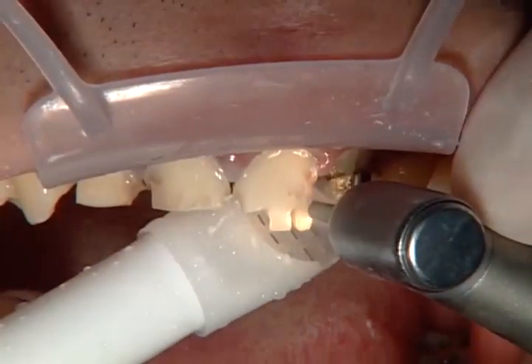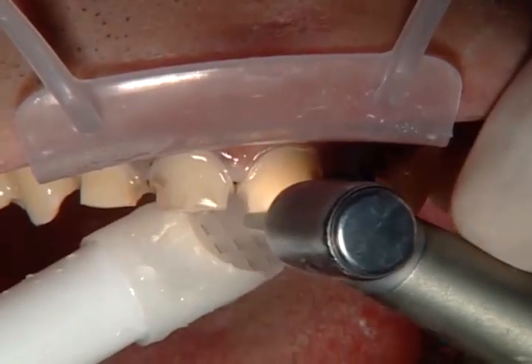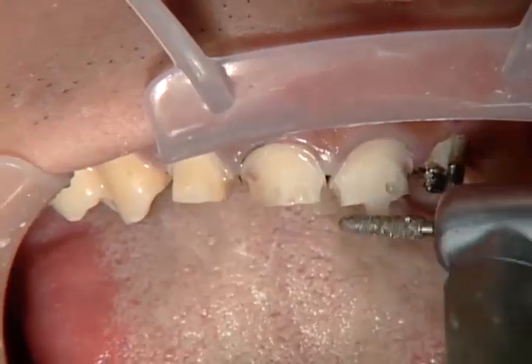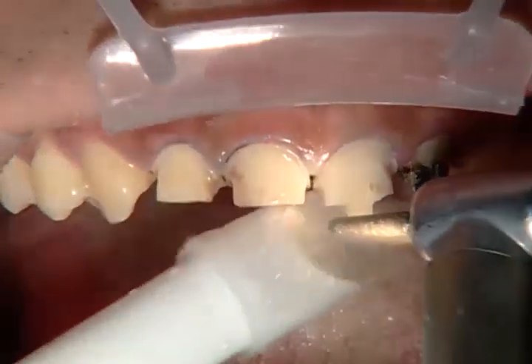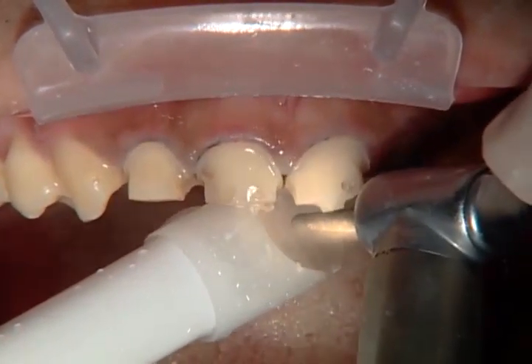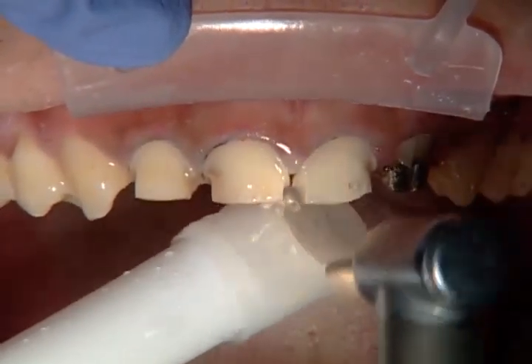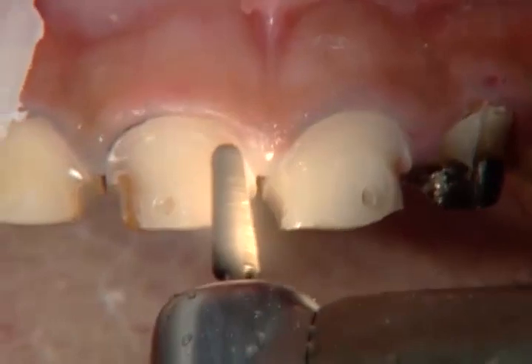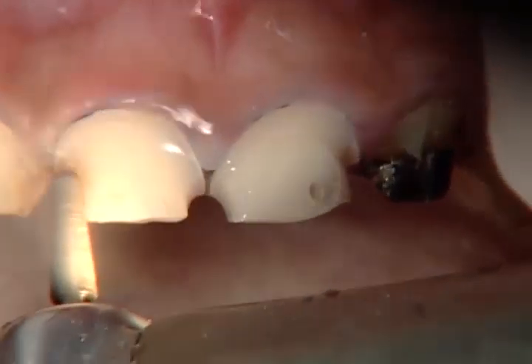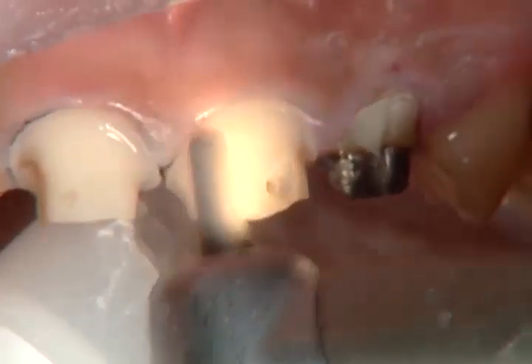And now we're going to go ahead and use our incisal edge depth cuts to do our incisal reduction. You can see we've got 2 millimeters left here. It's very simple to make sure you have enough reduction when you use a prep sequence like this one that's based on depth cuts. You're never left at the end of the preparation wondering if you reduced enough. You're never left with temporaries that are too thin because you didn't reduce enough. And that's why, even though it takes just an extra 20 or 30 seconds, I find it's well worth it to use a prep sequence like this that is in fact based on depth cuts.